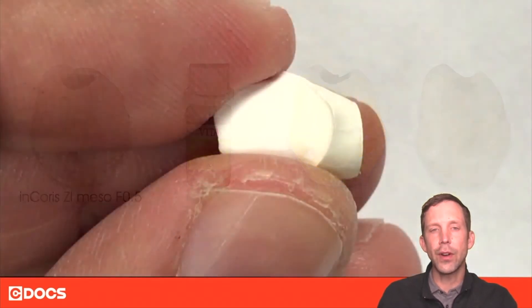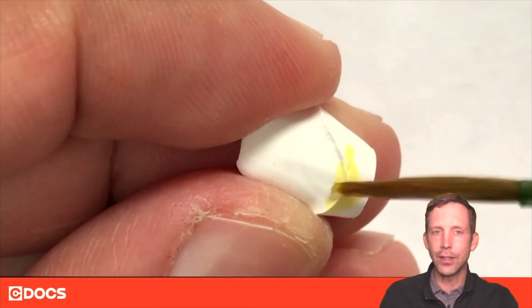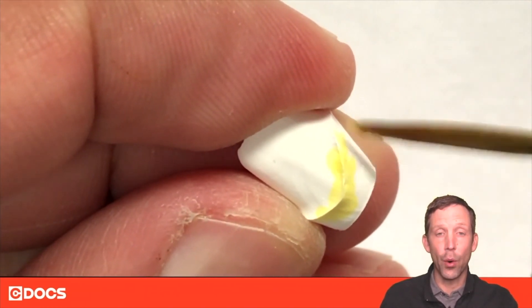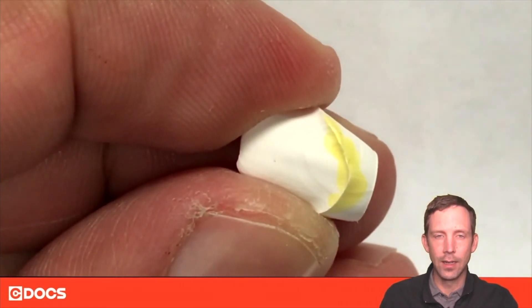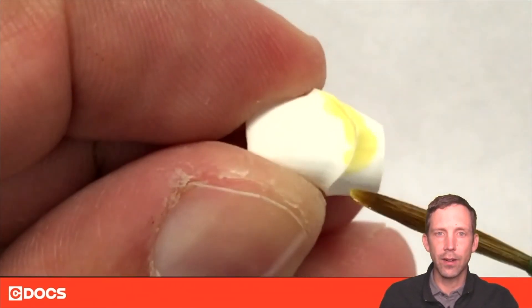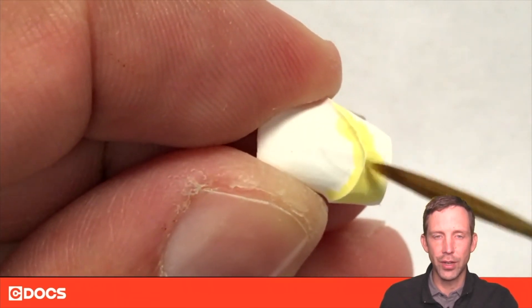It's very easy — it's not technique sensitive at all. It's kind of like painting or dyeing an Easter egg. The pre-sintered zirconia is very porous and it's going to absorb the color into the inside. You just paint it on prior to sintering, and when you sinter it, it comes out the new shade.